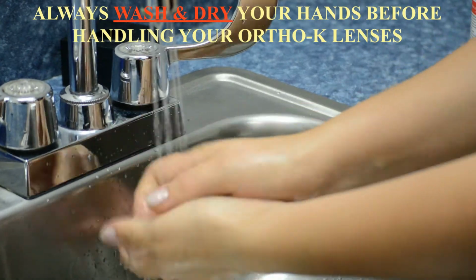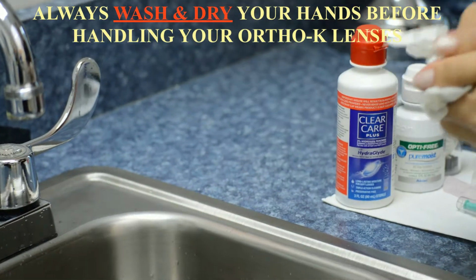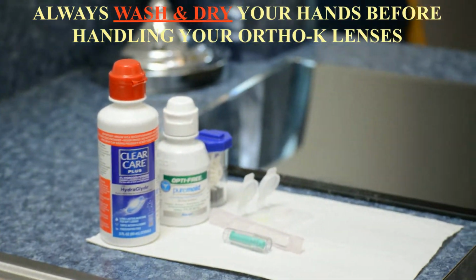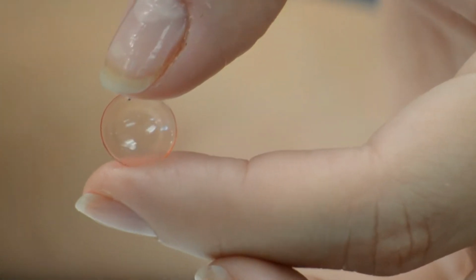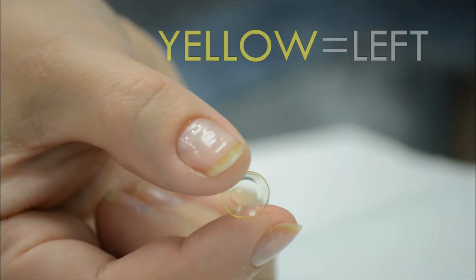Always wash your hands with soap and water, and dry them completely with a clean towel to avoid any water from getting into your lenses. Your doctor has provided you with 2 Ortho-K lenses, a red one for the right eye, and a yellow lens for the left eye.